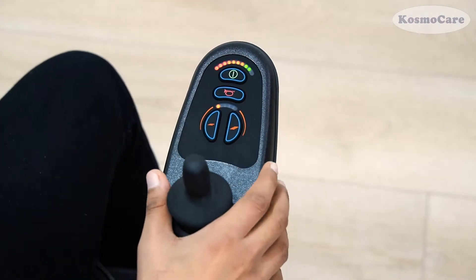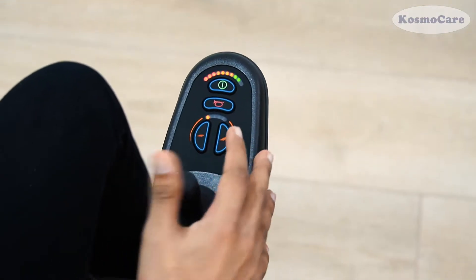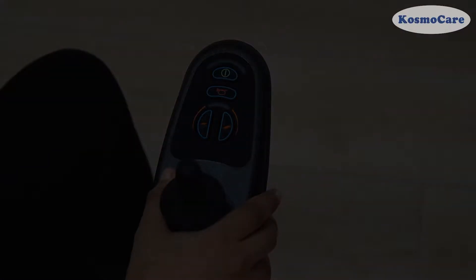Use the joystick to control the movement and direction of the wheelchair. The joystick comes with a little horn. Simply press the power button to turn the device off when not in use.